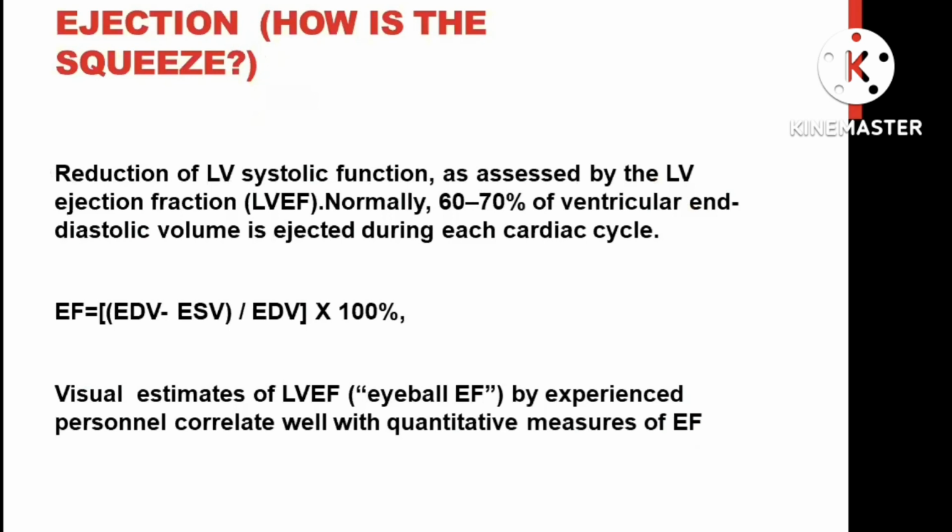Another is ejection fraction, or how is the squeeze. The normal ejection fraction is from 60 to 70. There are different reports, but go higher up. Some say 55, some 60.